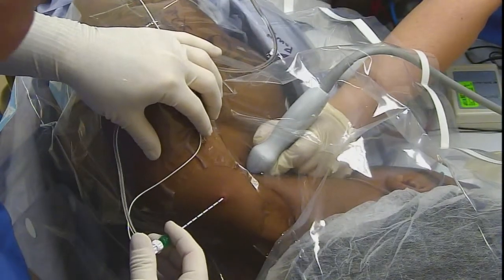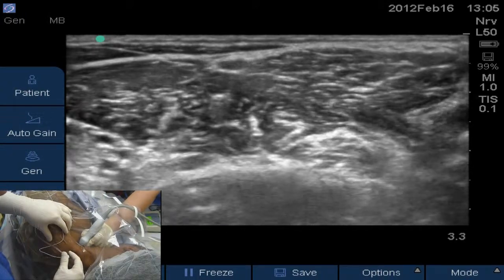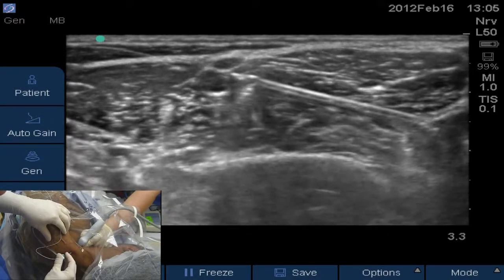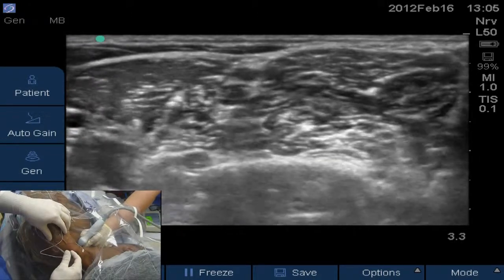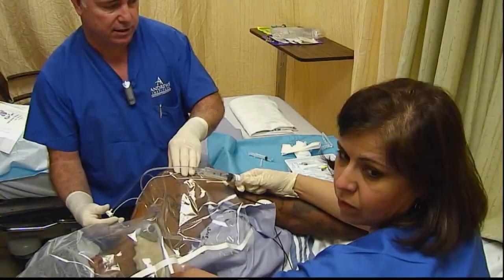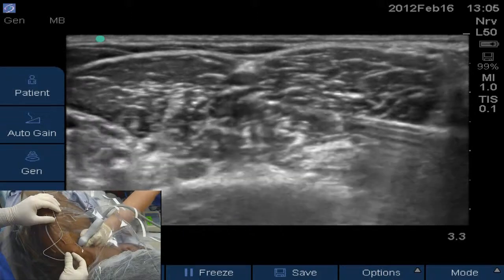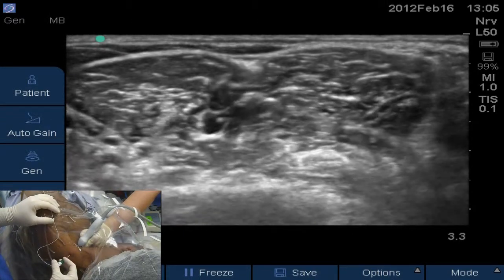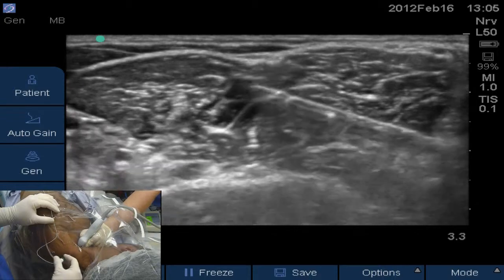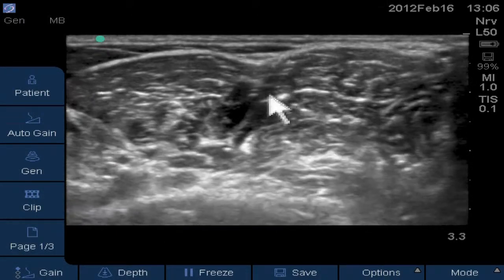We're going to start our approach posteriorly. Here comes our needle right through the middle of the middle scalene muscle. We want to see it that well so we can see the fascia of the muscle. We're going to come up to the nerves and pierce the muscle right there — I just felt a little pop. You can see the twitch over here in the arm and shoulder and down the arm it's twitching. Now we're going to aspirate and give a five cc injection. You can see it's opening up that area. Another five cc's right there, opening up the space between the middle scalene muscle and the plexus, and give our last five right there.